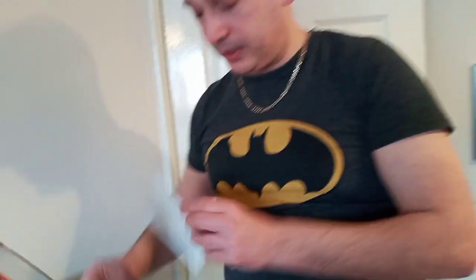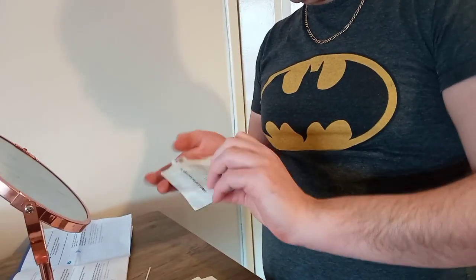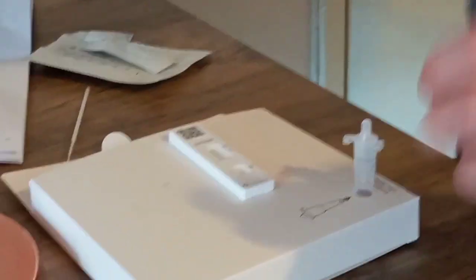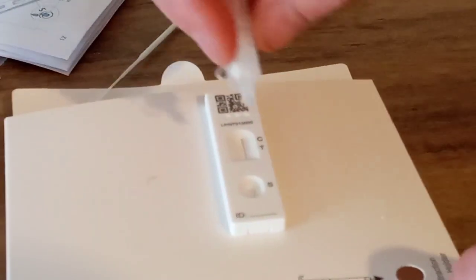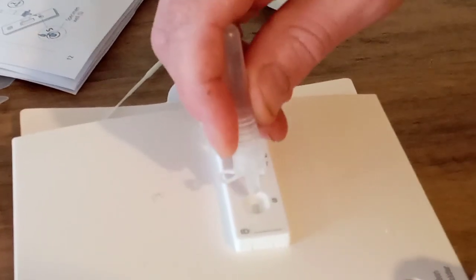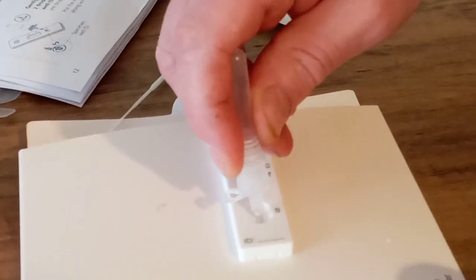Then we get our little rapid test, open it up, slide it out gently — here we go. Put it down. That's a thing to keep it sanitary. You've got to make sure you don't get an air bubble, it says, so turn it upside down and squeeze twice — one drop, two drops. And we're done. Now we just have to wait 30 minutes and come back to it.